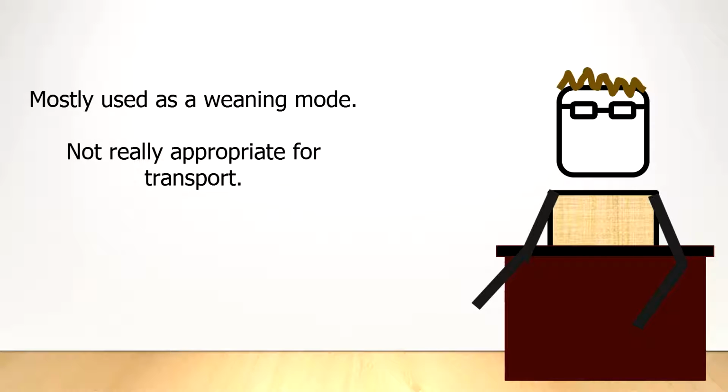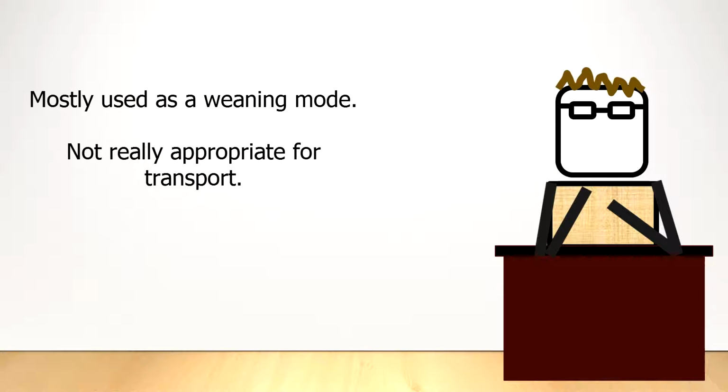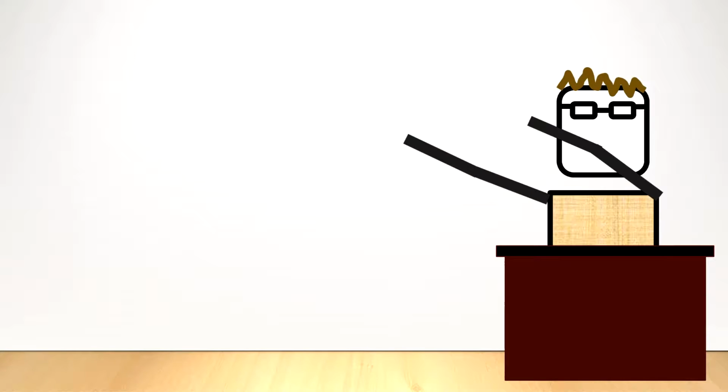In the pre-hospital environment, pressure support is not a common mode of ventilation used because this is the mode we primarily use when weaning a patient from mechanical ventilation. It's not usually used in transport also because there's really no guarantee of the tidal volume delivered and the minute ventilation. As well, it's generally not a good idea to have a patient sedated and paralyzed and then expecting them to control the entire ventilation cycle.